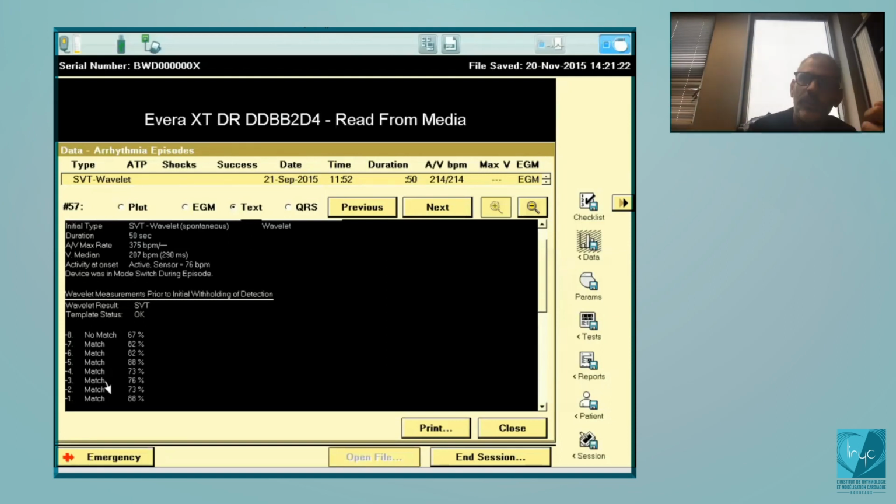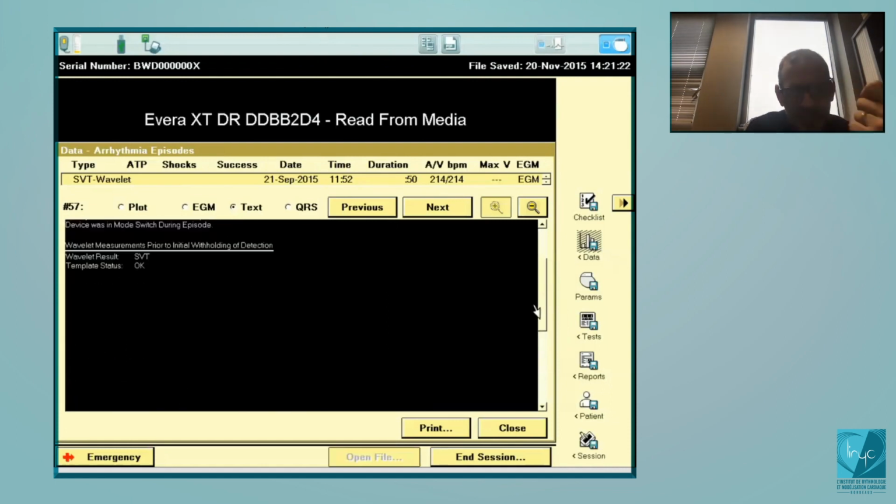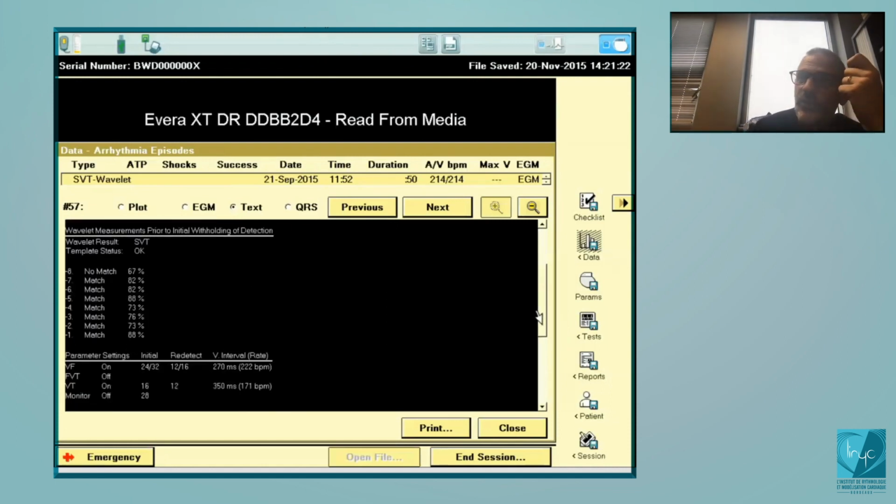Then you will ask the PR logic. And in many cases the PR logic will say, okay, that's atrial fibrillation. But if the device says this is probably dual tachycardia, then you can have a correction with the wavelet. Okay? So many steps that may explain why at the end you will considerably decrease the rate of inappropriate therapy in case of conducted atrial fibrillation. Okay, but let's have a look to the last tracing now.